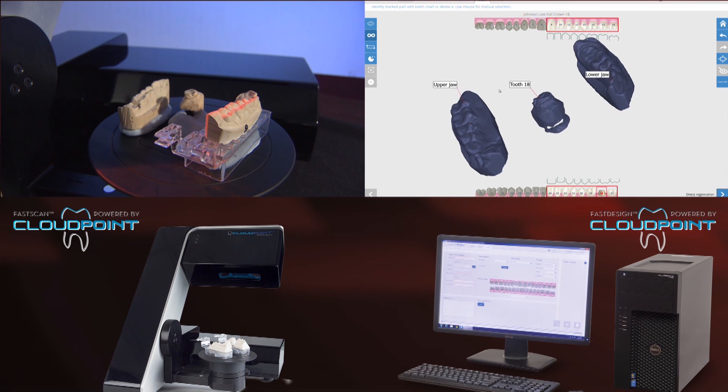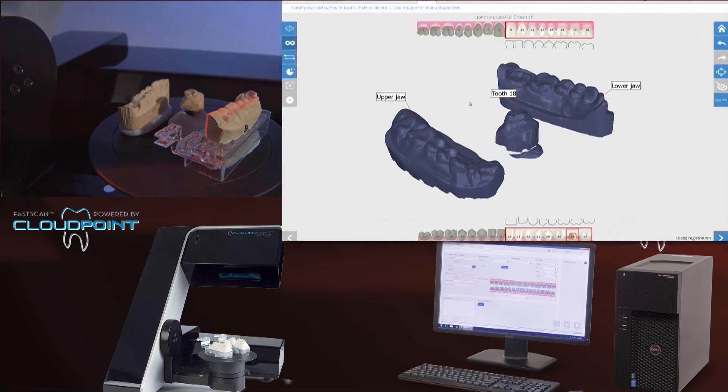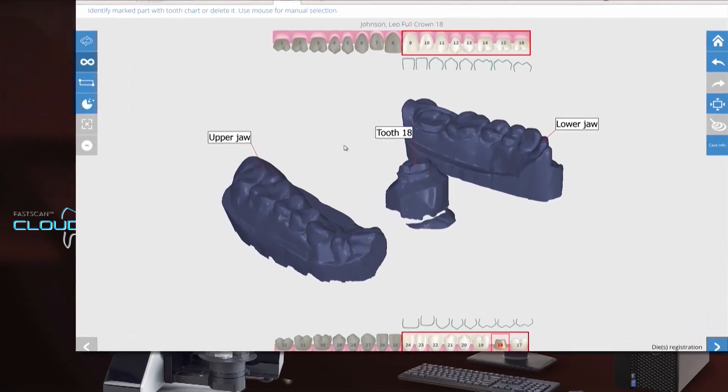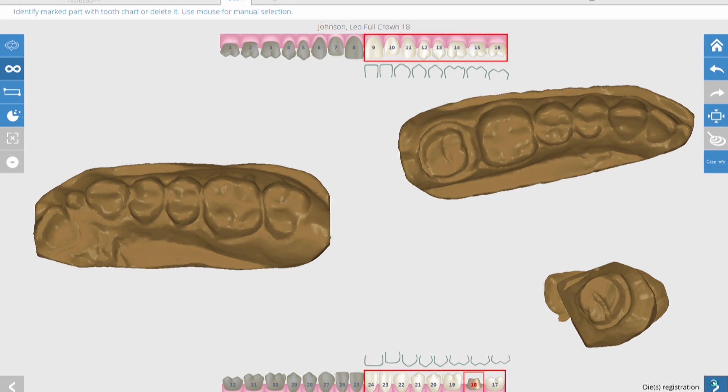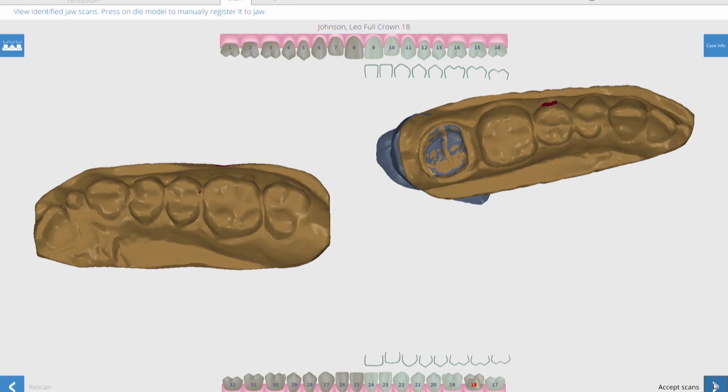You can see it took just over a minute to get both arches and the die by itself, and that's definitely faster than you would see with any intraoral scanner. It takes a little bit longer to do that.